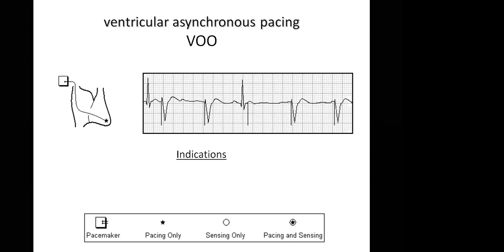Okay, sir, one last question. I actually wanted to ask, would this kind of case generate ventricular fibrillation? Well, that's the risk inside. That's why I said it's for a short period. And if you see a VT, you shock the patient in the theater. That's why the anesthetist is there. It's better you save the patient by ensuring he's pacing all the time than you assume he's pacing and he's dead.